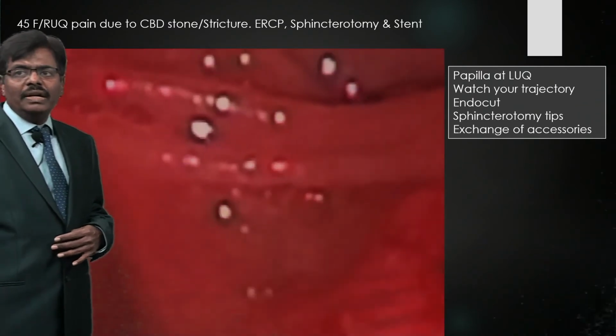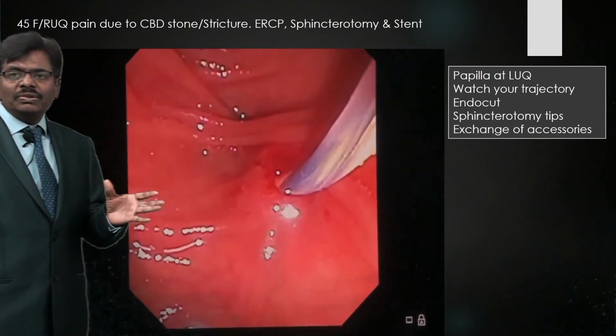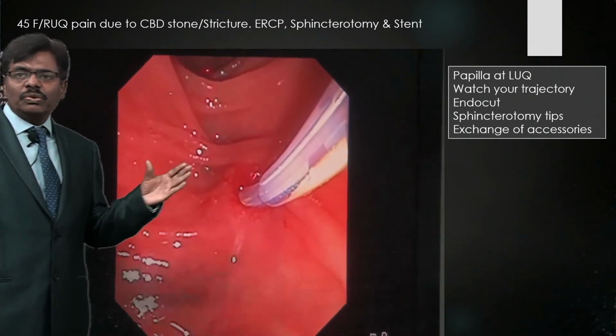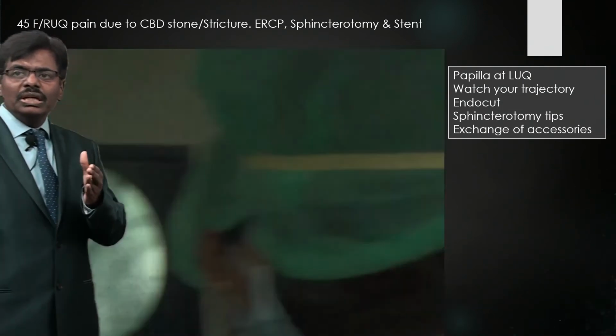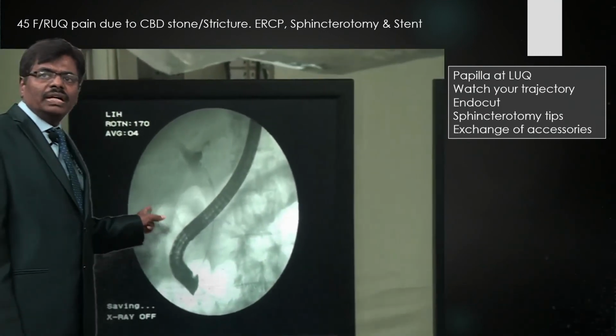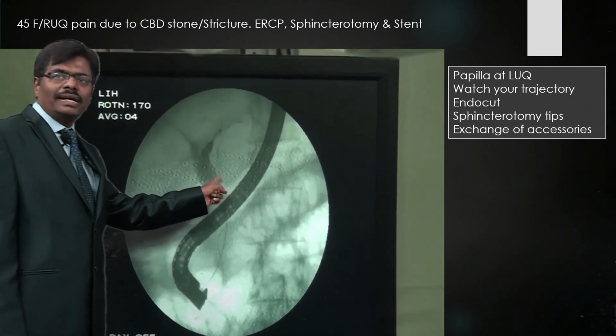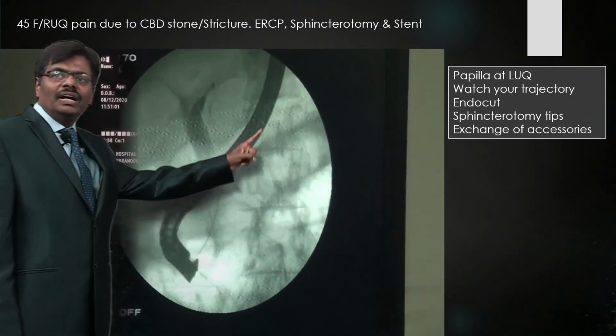Here we have an unedited video, so my anesthetist is actually taking the camera, moving from my endo view to the C-arm. That's why, sorry for that. Otherwise you are able to see we have cannulated and taken a contrast, and you can see the guide wire inside and also the contrast, a dilated duct, you can see here, and nicely shortened.